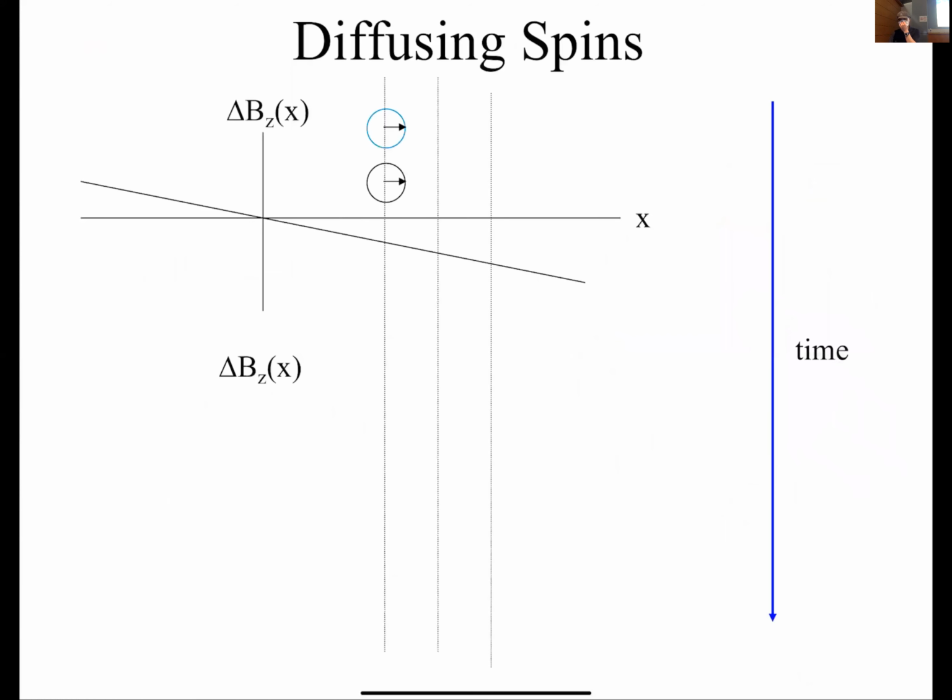So we want to relate it a little bit to MR. Today we're just going to give you a sense of how you can use MR to be sensitized to diffusion. And we have to go back to understanding how spins add up to give you a signal. So imagine I have two spins that are in phase, right? If I look at a signal, they would add up together and I get some value out. Now what I do is I apply a gradient to these two spins. Right now they're in the same place in space, so they experience the same gradient. So they would precess the same way.